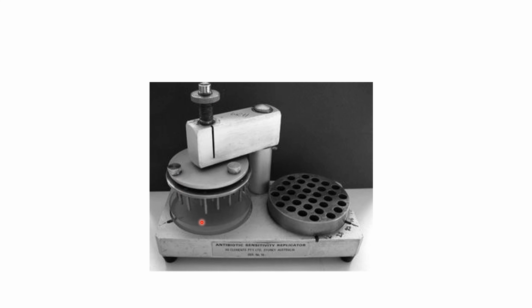And this equipment is called a multiple inoculator or steers replicator. And we said that in this agar dilution, many strains or multiple strains can be inoculated on Mueller-Hinton agar of different concentrations of antibiotic for calculating the MIC.